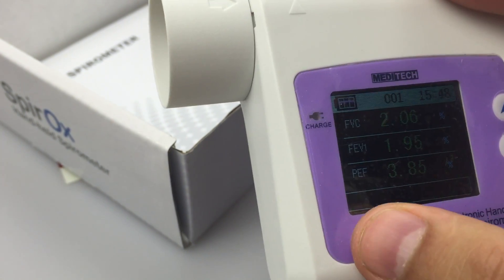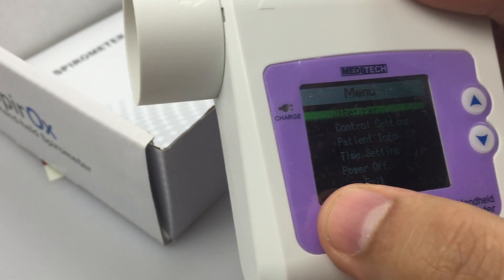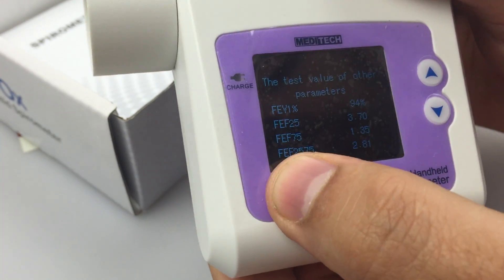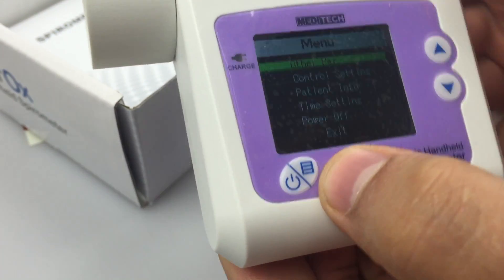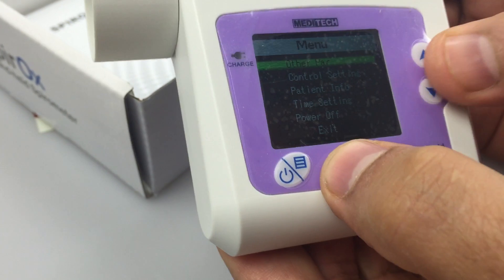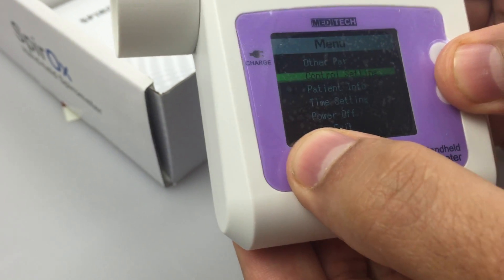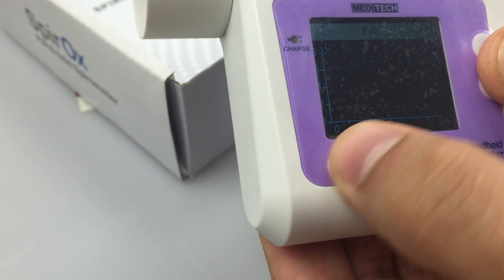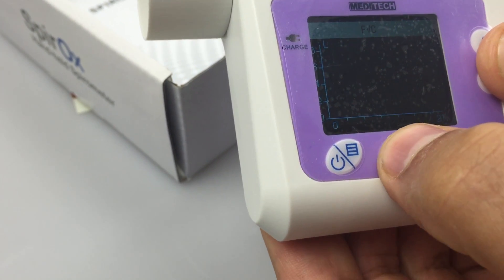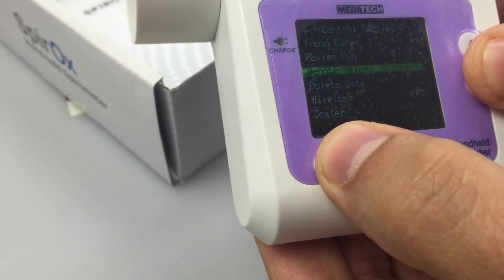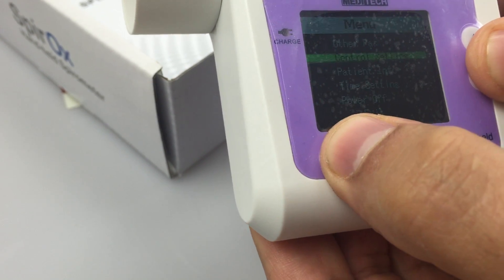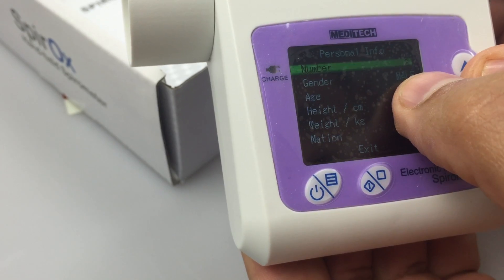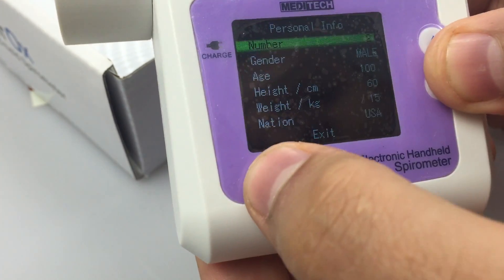Here is the result. After connecting with the computer, we can see the function and the other trends here. The record number is already shown here.